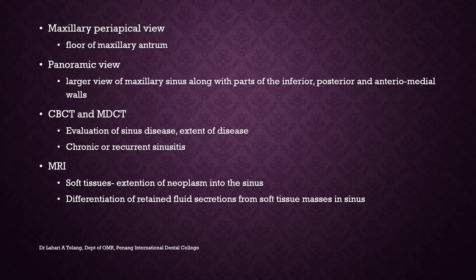The floor of the maxillary sinus may not be viewed very clearly, for which you might have to rely on images with higher resolution and 3D imaging like CBCT and multi-detector CT scans, which help you evaluate sinus diseases and extension of diseases, as well as chronic or recurrent sinusitis. MRI can be used for soft tissue views or soft tissue extension of neoplasm into the sinus, and differentiation of retained fluid secretions from a soft tissue mass in the sinus.